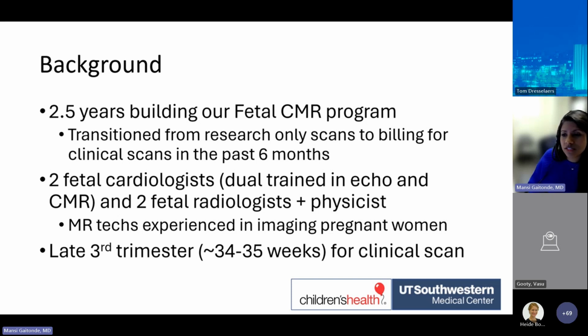And we have a nurse who's dedicated to our cardiac MRI scanner. She helps mothers as well when they're coming in. And then finally, we have a scheduler who's dedicated to our MRI scheduling. That really helps, at least in the United States, when it comes to issues with insurance and billing. Our scheduler facilitates all of that ahead of time so we can get our scans covered. We're doing them in the late 3rd trimester for our clinical scans.